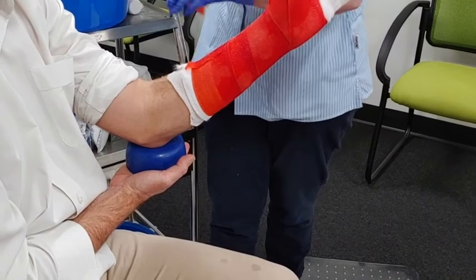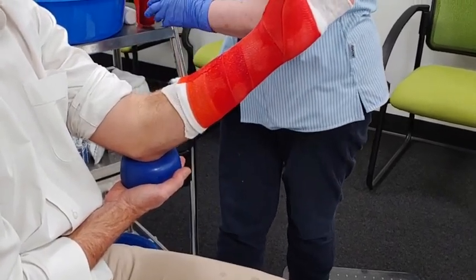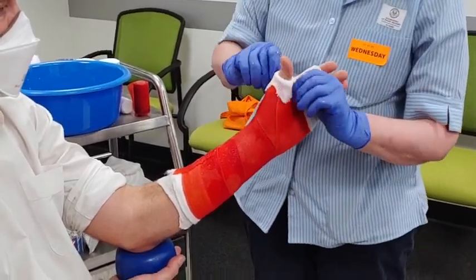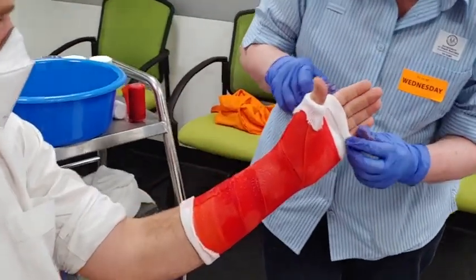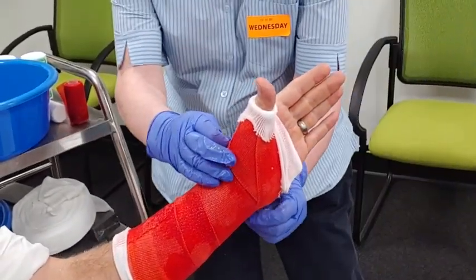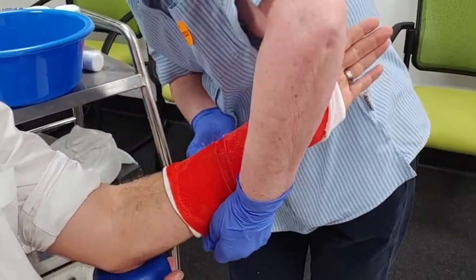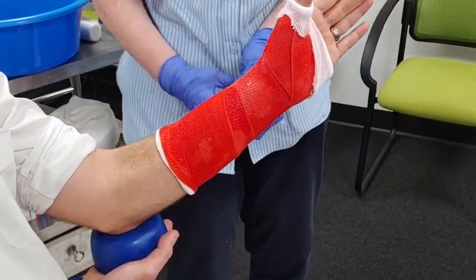Ensure you've also done a neurovascular status check at the start as well as at the finish — you don't want your patient to be compromised. Wet your hands because it gets quite sticky. Bring the thumb down first, then bring the stocking piece up and pull the other bit down so you've got the palmar crease on view. The metacarpals are also at free view at the back. If you're quick, you may be able to do it all in one roll; if your room is really warm or it's summertime, you might need two rolls — so always get out an extra roll.